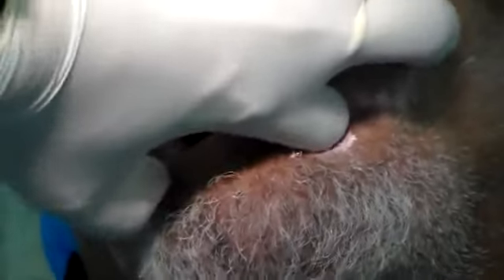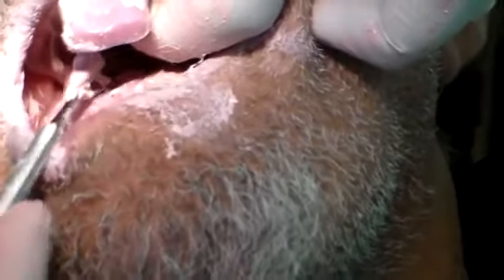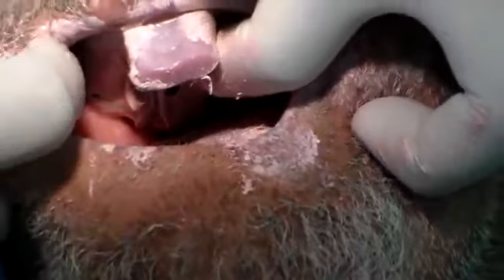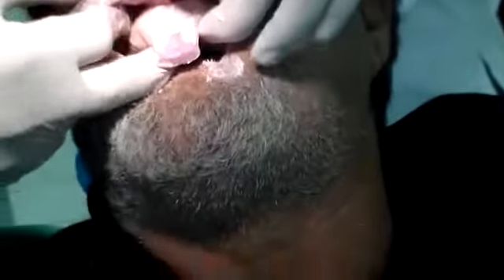I need to help my patient a little bit. I'm just going to take my instrument and keep the phrenum, and just slowly take off some of the material so that everything is not struggling anymore. I'm just trying to take off the material that was flowing into the palate.